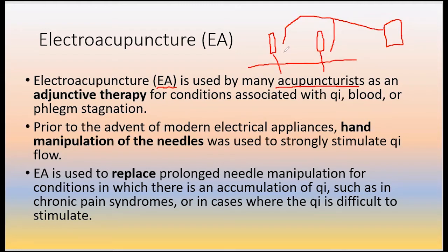Depending on what kind of needles you use, if you use metal handles, certainly you can connect the clip on the handle part. If you use plastic handles, you can't connect the clip on the plastic part. You must connect it on the body of the needle, but make sure they are well connected, because the needle bodies are pretty thin. Metal ones you can still connect on the body part, so you just have more choice: connect to the handle or to the body.